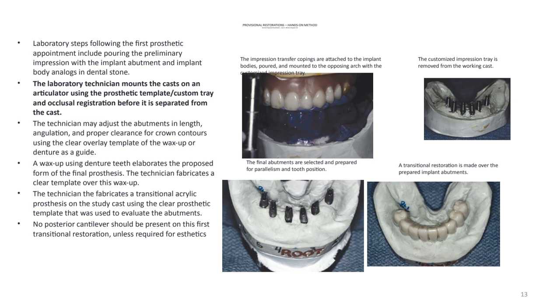So this is exactly what we keep presenting: the dentist sends us the impression with the missing teeth, then we have to fabricate a cast with the full contour teeth and mount the case, ideally using a semi-adjustable articulator, then insert those temporary abutments in the model and use them as an anchoring for the temporary or provisional restoration.